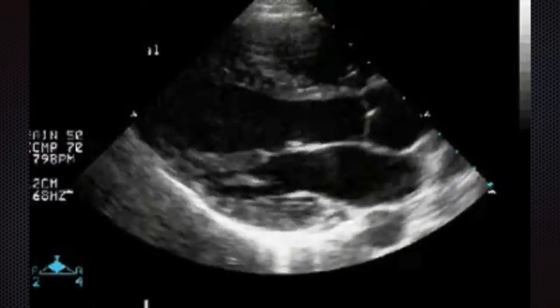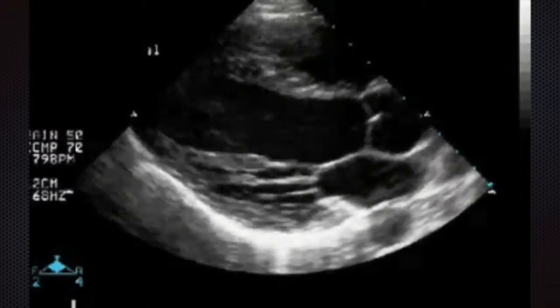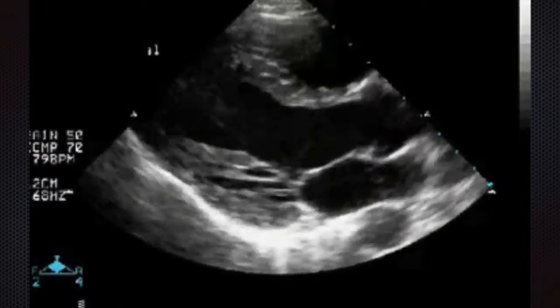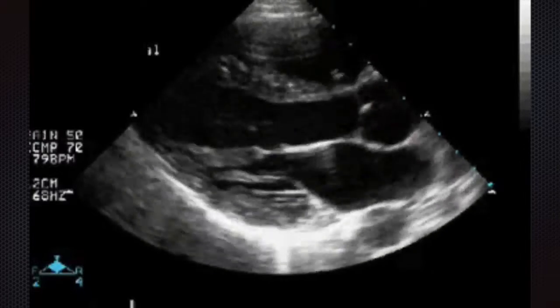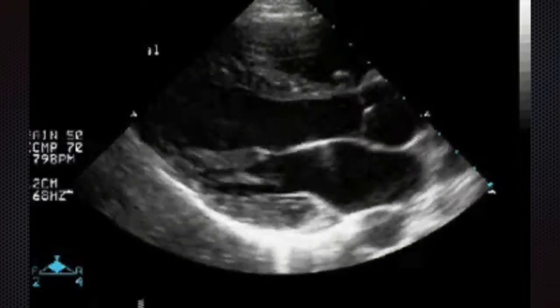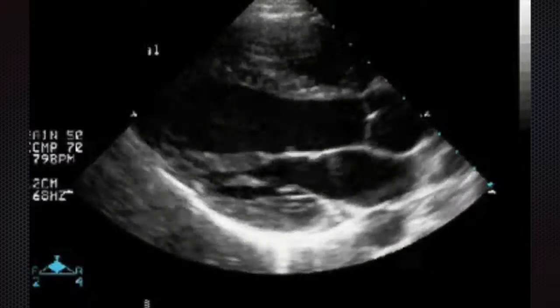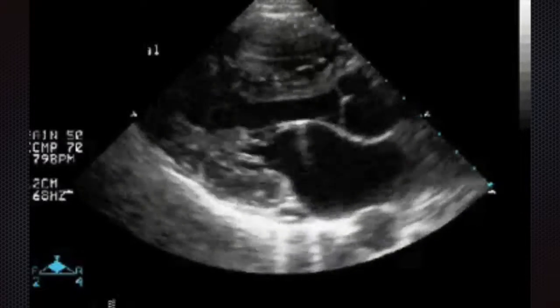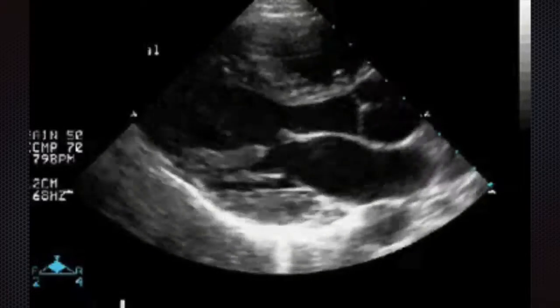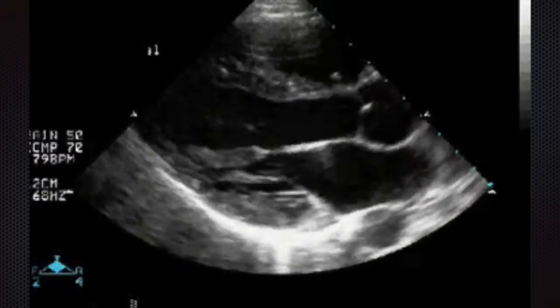If there's only one person shuffling along at very low speed, you wouldn't imagine the door would open very wide or very rapidly. And that's the way to think about the mitral valve. If you're really interested, the way the mitral valve opens and closes is called the EPSS, the E-point septal separation. But you don't need to know its name, you just need to look at it and say, does that happen?